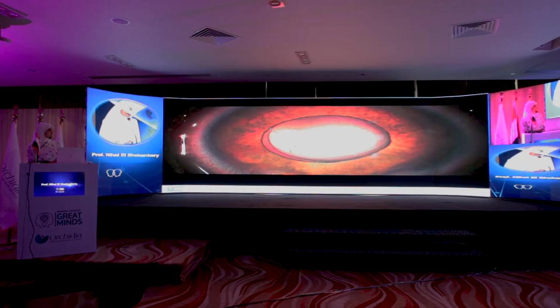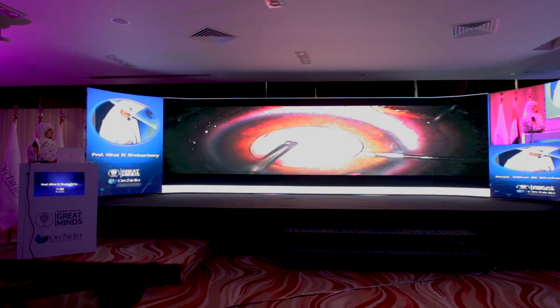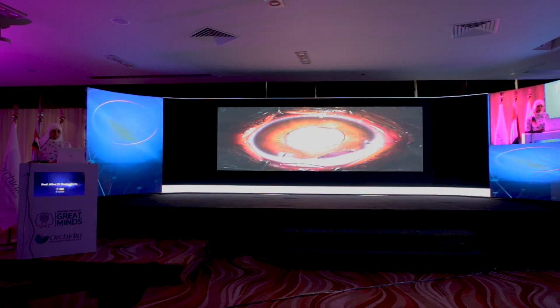So the treatment from the start was not to start with the glaucoma, but to start with lensectomy. So immediately we performed her lensectomy, here the microspherophakia, irrigation aspiration. This is the small capsular bag, eaten up with a cutter, performing anterior vitrectomy, and finally closure of these tiny ones before proceeding with the glaucoma again.